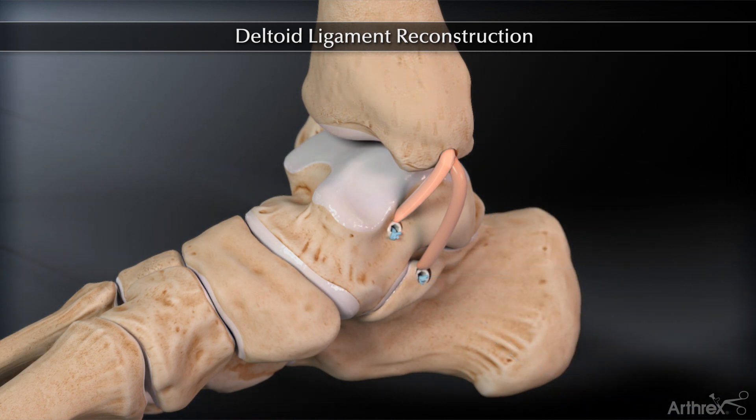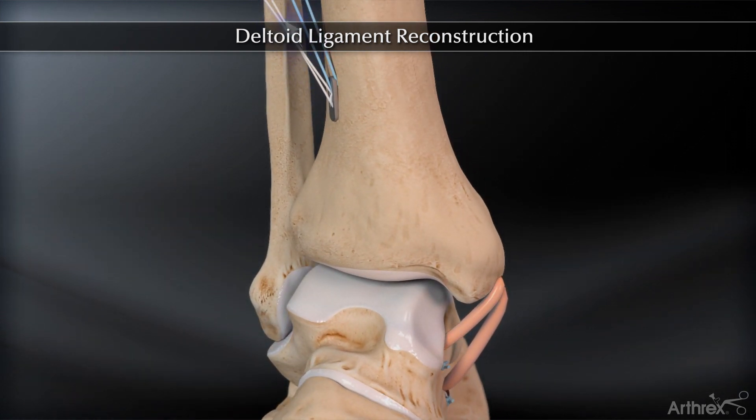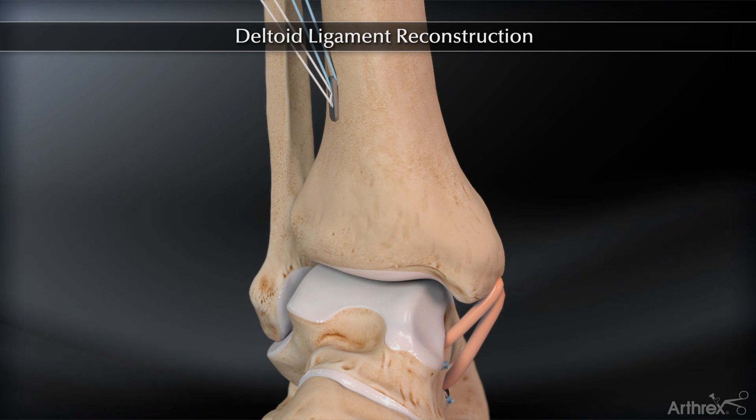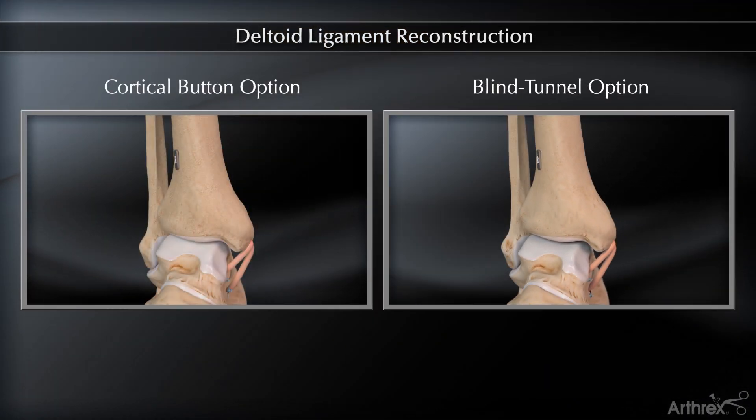Final tension of the construct is achieved by once again toggling the white tightrope sutures exiting superiorly at the tibia. Once proper tension is achieved, the blue tightrope sutures are pulled out of the button and the white limb should be cut. This completes the repair.